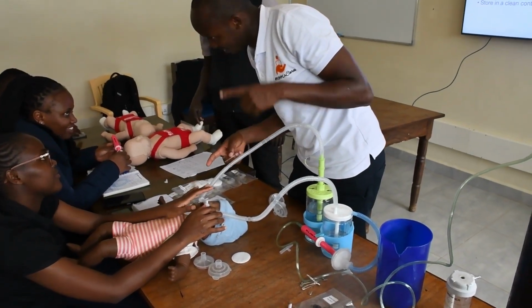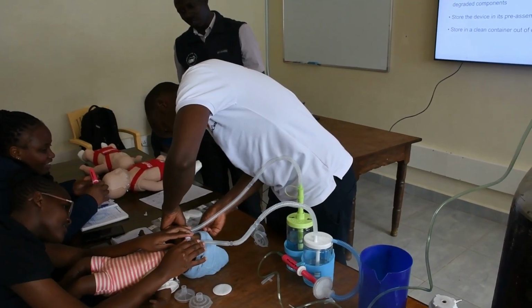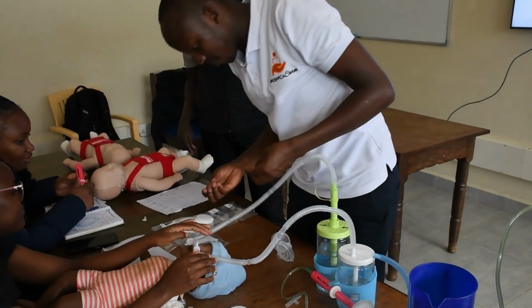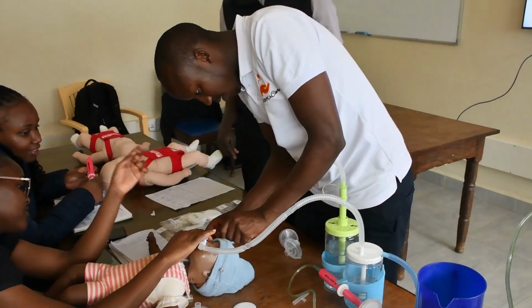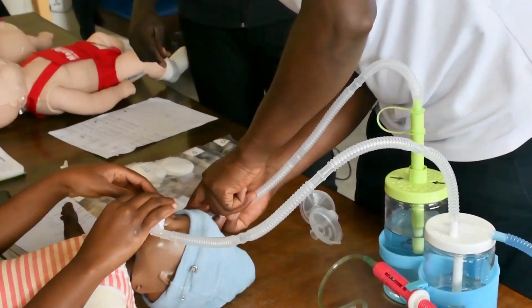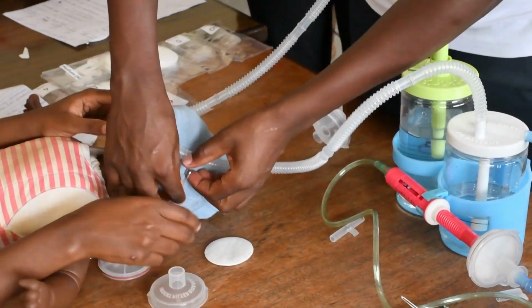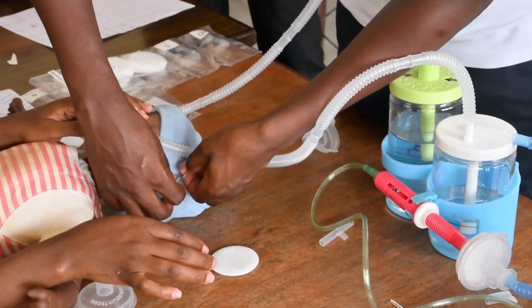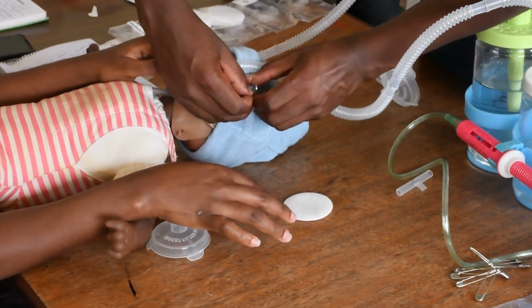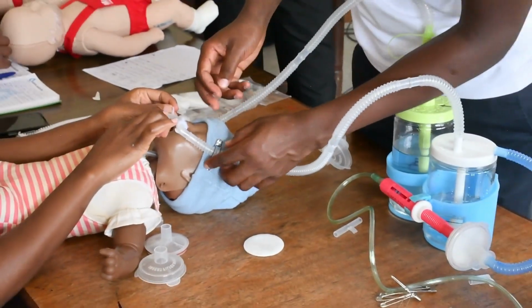But make sure you do this away from your patient. The other one, you secure this.